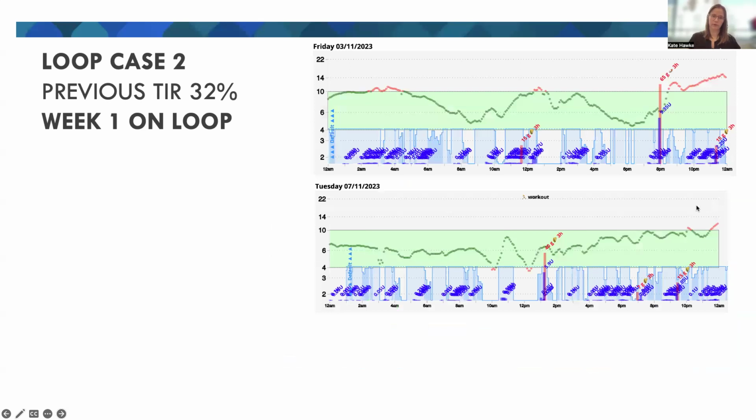However, from the patient's point of view, this was a really dramatic change. And even though she had felt that she would like to get her glucose levels much lower, once she was actually there, she felt a bit uncomfortable. Was uncomfortable with trending down overnight. And even though it was only 0.7% time below range overall, some of these events were troublesome for her.